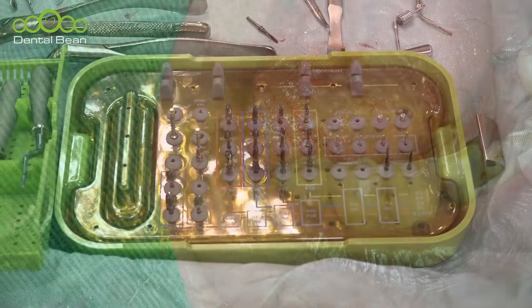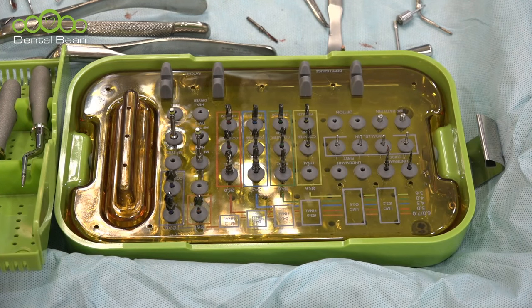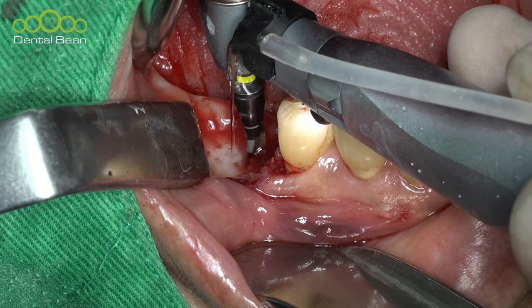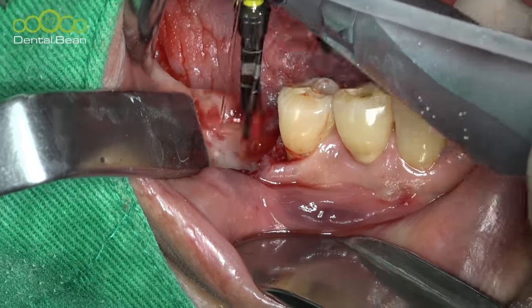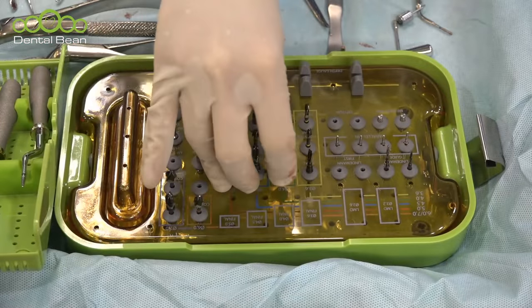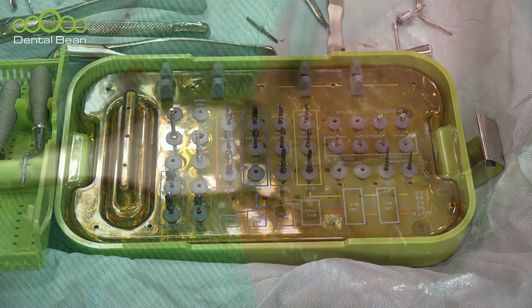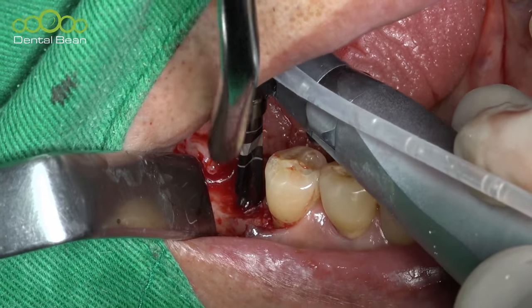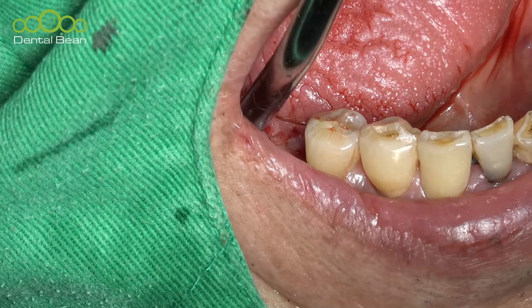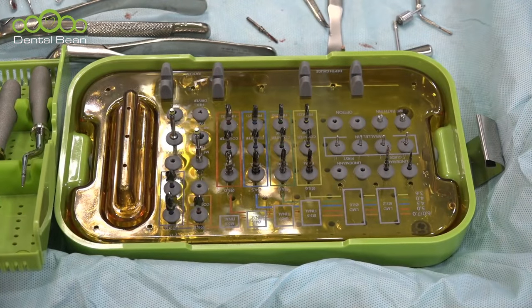Okay, next drill. 3.6. Right here. Next drill, 4.0. I want to skip 4.0, 4.5 directly. Okay, 4.5 implant, please. Okay, I will install the 4.5 Dentium implant.